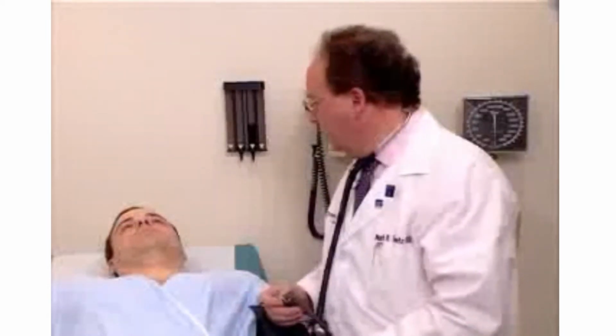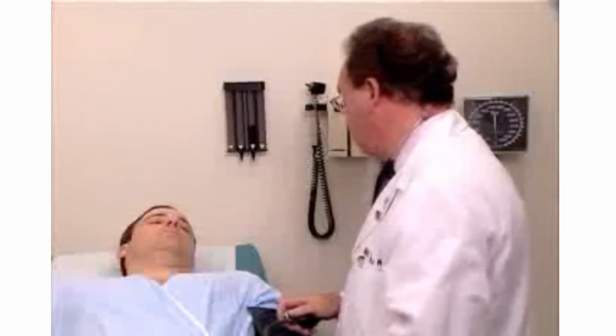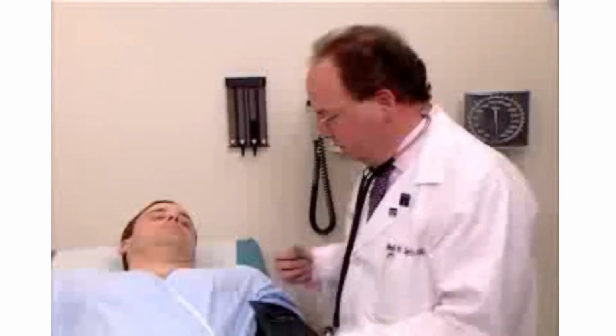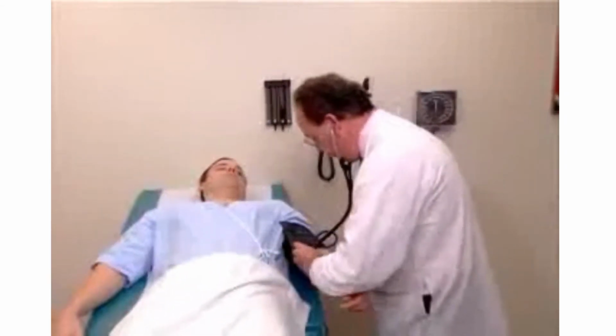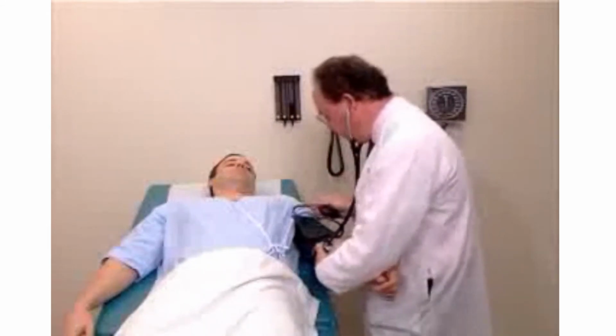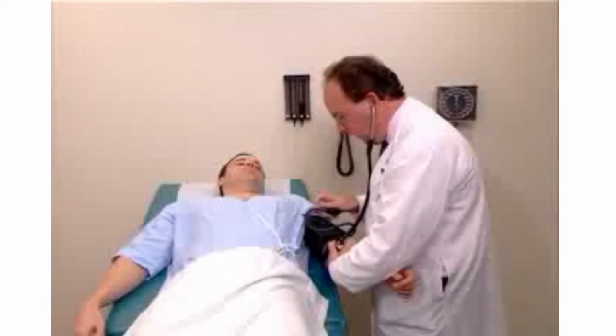The final assessment of blood pressure determination is orthostatic hypotension. What I'm going to ask you to do, Mr. Johnson, is when I tell you, I'd like you to sit up rapidly. Make sure that you are ready to determine blood pressure by having the set screw properly tightened. Mr. Johnson, I'm going to ask you to sit up in just a moment. Okay, are you ready? The set screw is tightened. And please sit up for me now.